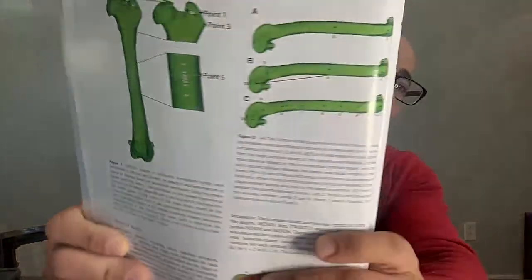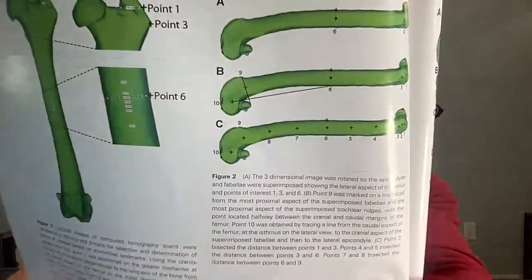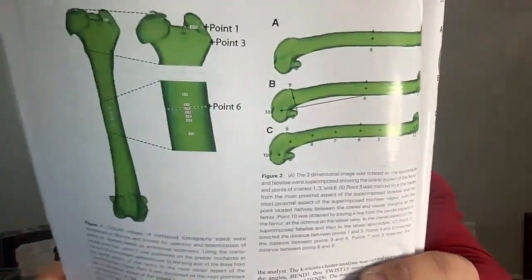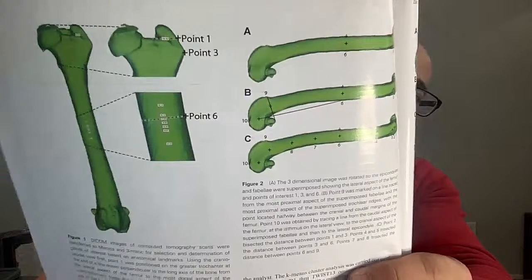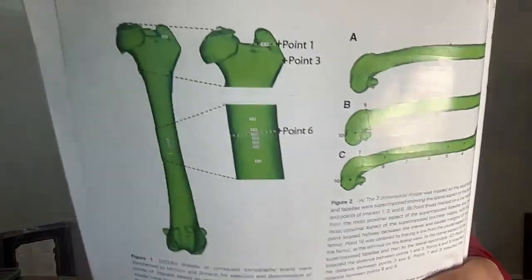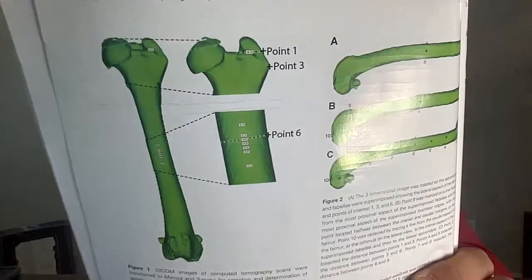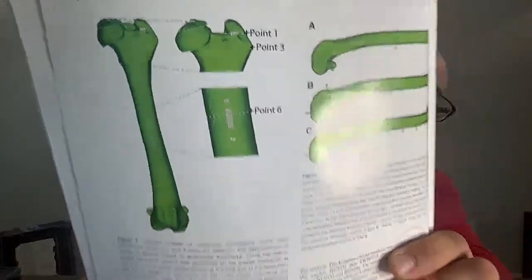So this is the imaging here. I don't know if you can see, the numbers are very tiny, but there are numbers on there, and that's where they try to assess the bending and twisting areas. And if you look at point number 1 there, pointing at the greater trochanter, that's one that had the largest bend to it, and so that's pretty cool there.